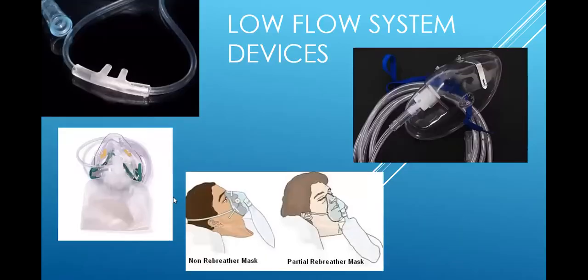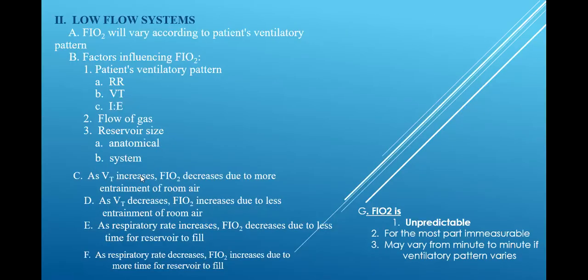All right, one more concept. We'll finish this slide and then we'll take a break. Now, we talked about how the volume affects the FiO2, but what about the respiratory rate? Think about this before you answer. How will the respiratory rate affect my FiO2? Well, it's going to be based on the reservoir, right? I told you.